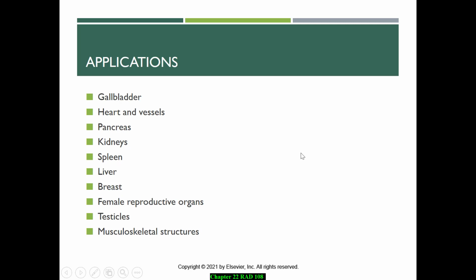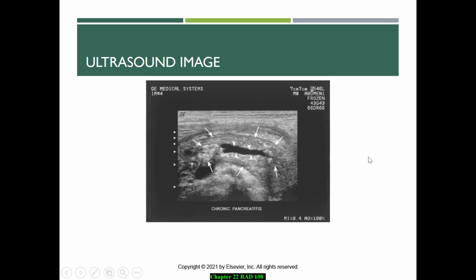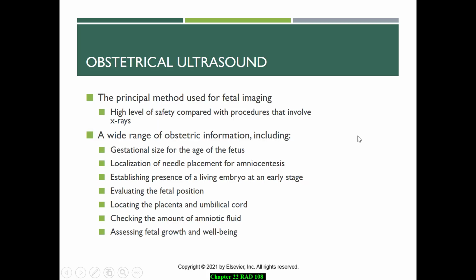So you're really seeing a movement with breast ultrasounds being done over mammograms. So they will take a look at those. You can look at your kidneys, your heart, your vessels. Even in males, we can take a look at body parts for ultrasound images. So here's an example of an ultrasound, and this is a pancreas that we're looking at.